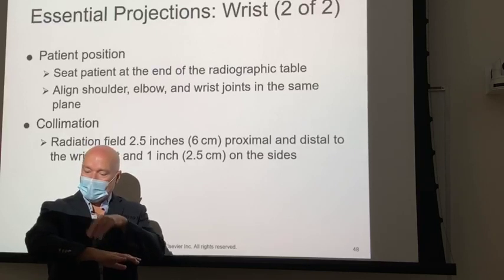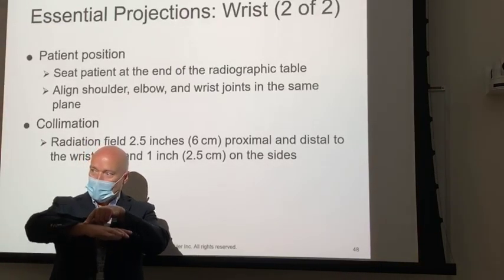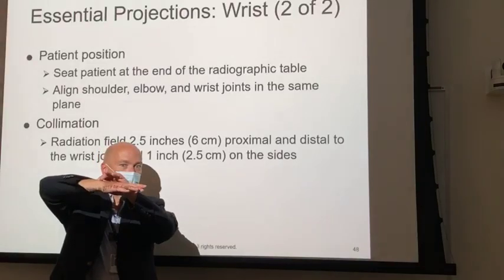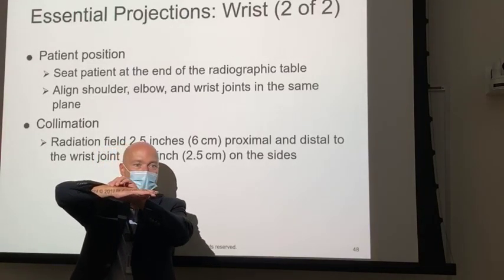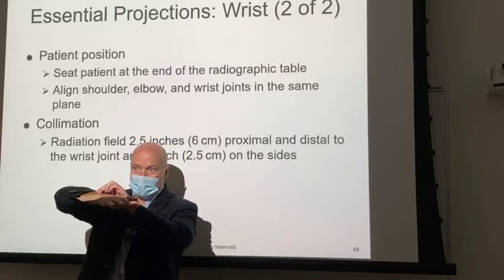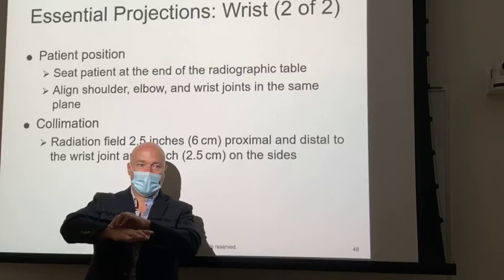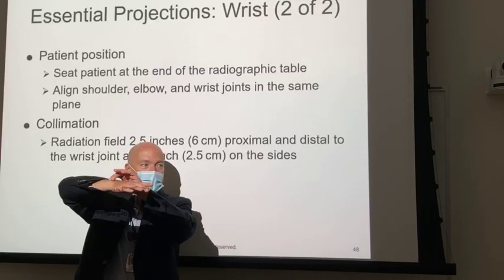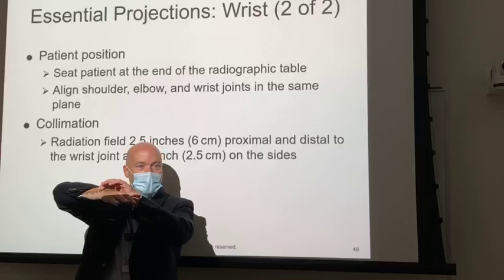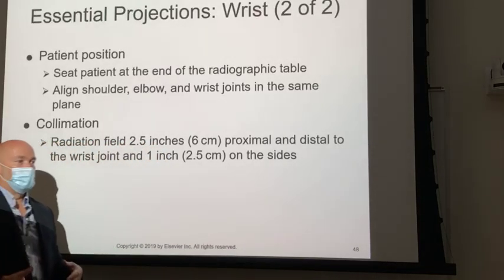But if you keep your finger on that and you elevate your arm until everything is at shoulder level, what do you feel? So you get it down here, you feel it sticking out of the back, and you come up, and you come up, and what happens? It disappears, right. So it rotates out so that you would see it in profile.